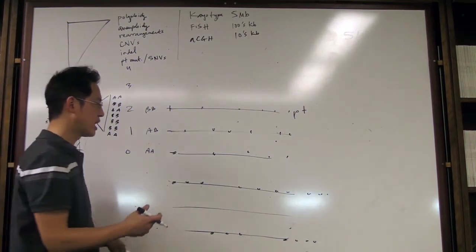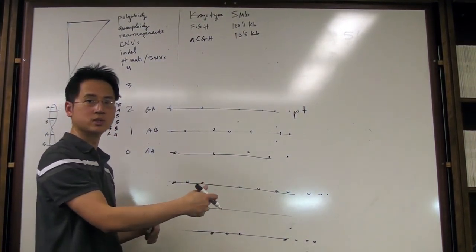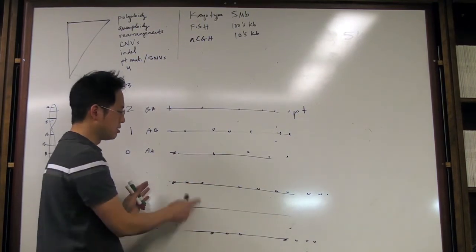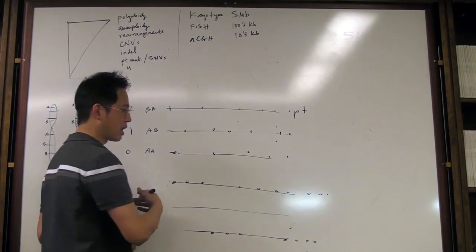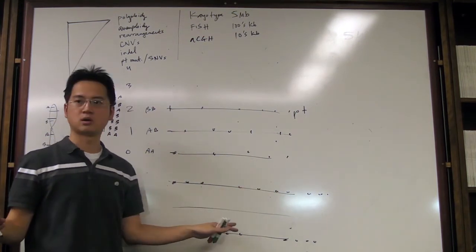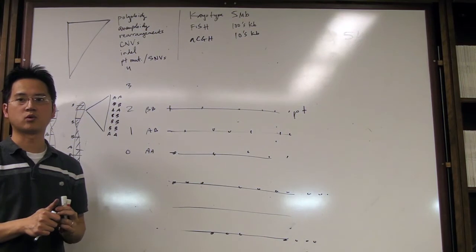So by chance, you could have a region that is not very well peppered with SNP probes, and you have 10 things that look like this, maybe it's just because you don't have enough sampling. So chances are, yes, you may get a situation like that in a normal case. But absolutely, when you see hundreds and hundreds of these giving you a 20 megabase region that looks like loss of heterozygosity, that's when it's going to look like UPD and will probably be abnormal.